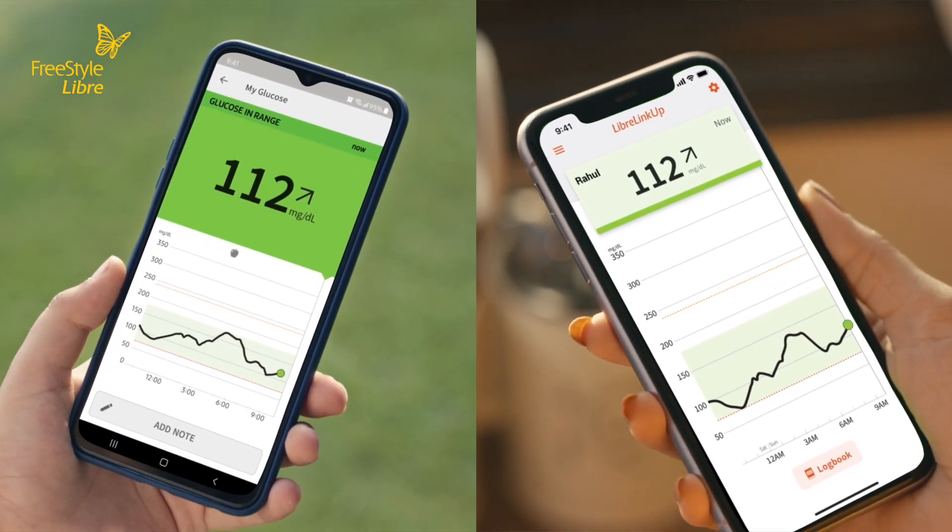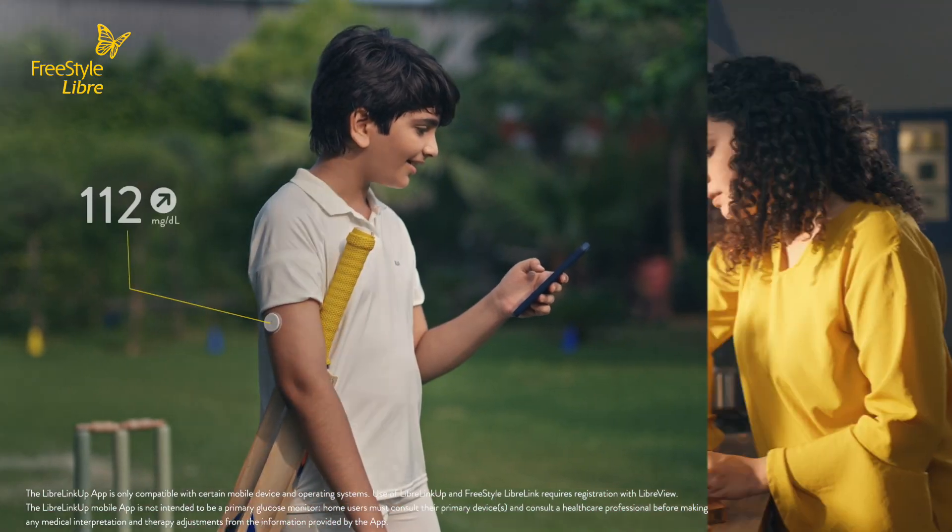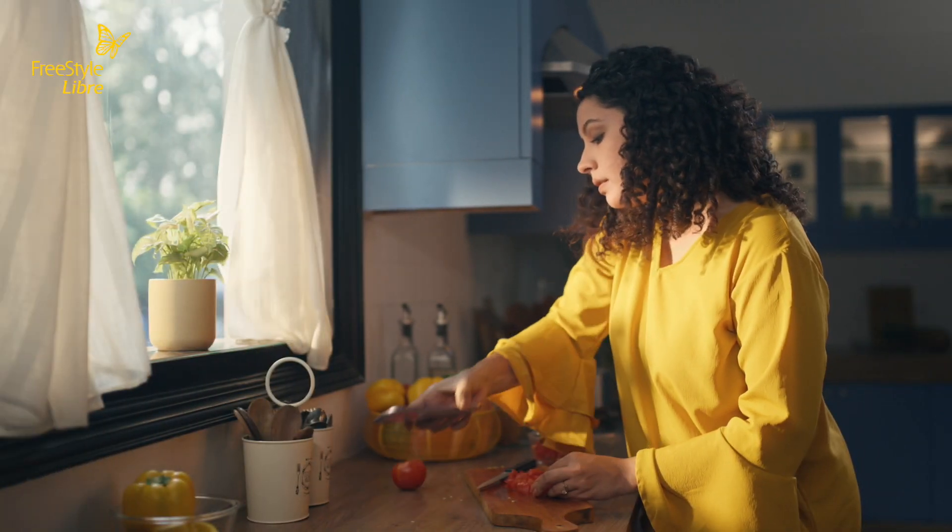The LibreLink app can also be connected with the LibreLinkUp app, allowing your loved ones to receive notifications of your glucose readings.